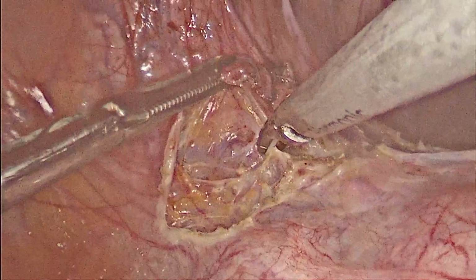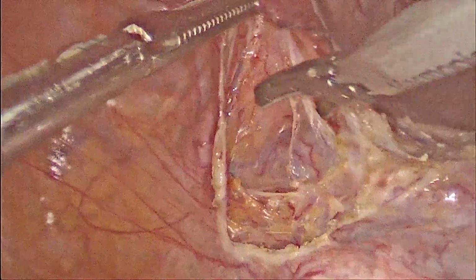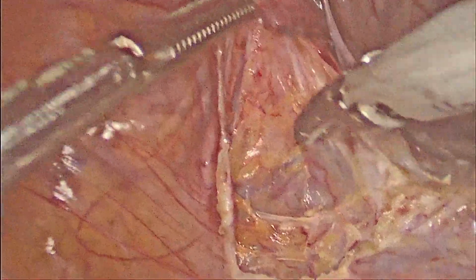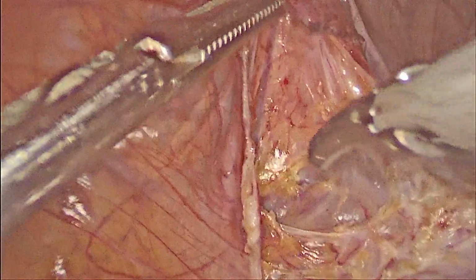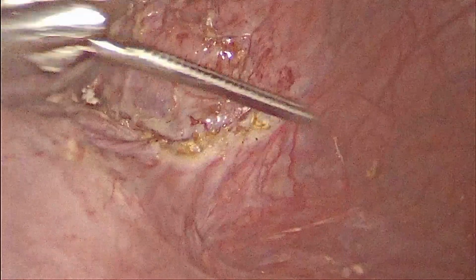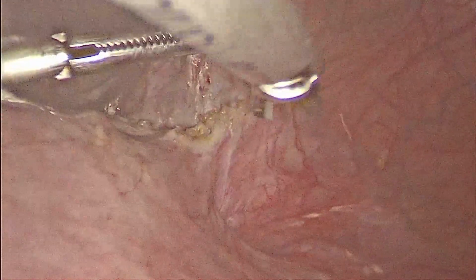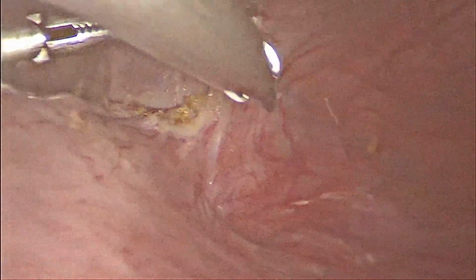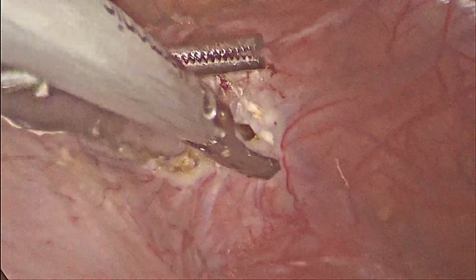And the vascularity at the scar pregnancy will lead to more blood loss, or we may go in a wrong plane. So keeping medial and superficial to the uterine artery is also one more very good clue to keep the plane between the bladder and the cervix area. Once we are done with dissection on the left side, we are going to do similar dissection on the right side.